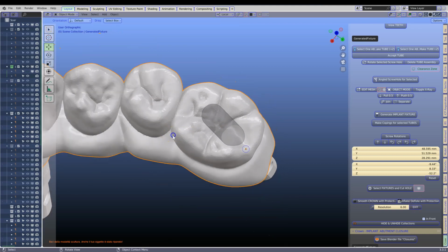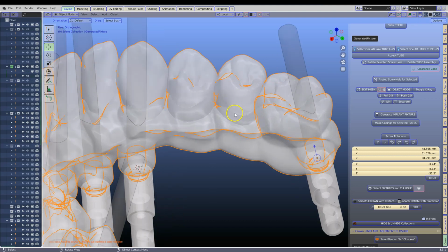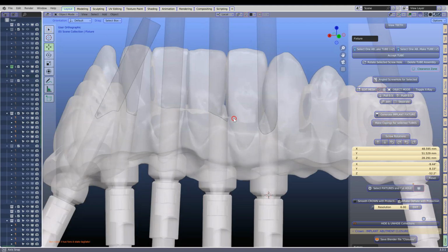Now this is the cool part. This is where the magic happens. I'm going to put it on transparent so that we can actually watch this live. Select fixture and cut the hole. How cool is that?